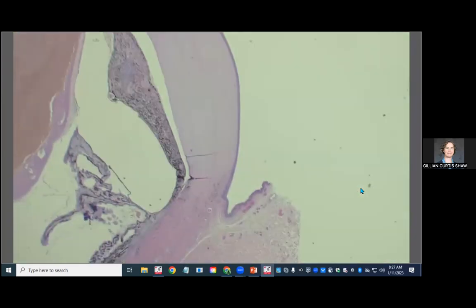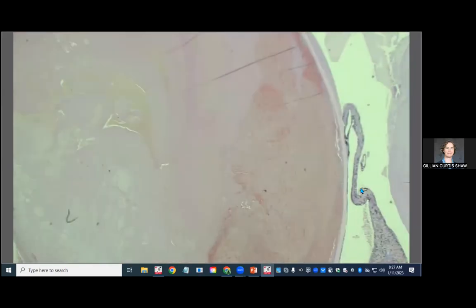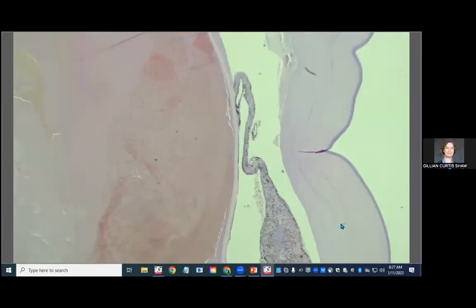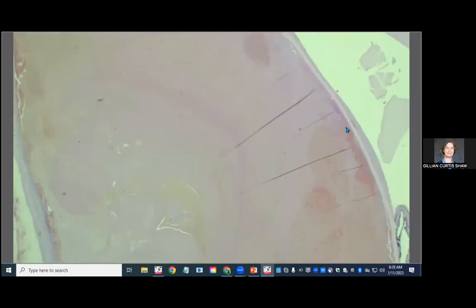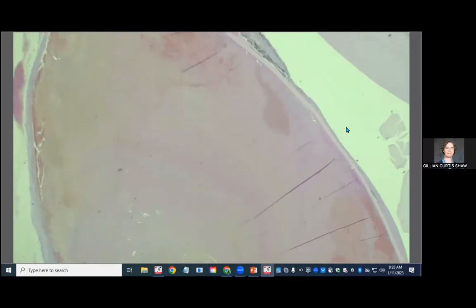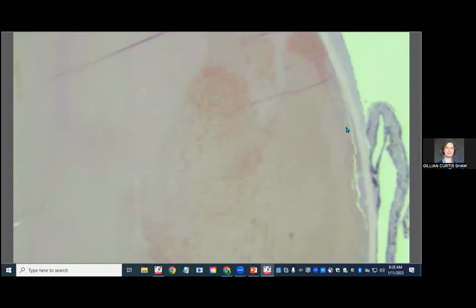So just to orient you, here's the cornea up here, and we're going to start on the lens before we do anything else. There is posterior synechia and iris bombé. You do see that this iris is fused to the anterior lens and thin and anteriorly bowed, but I'm going to skip straight to the lens because I think it's the most interesting. This lens has a pretty significant cataract going on. We would call it hypermature. There's barely any recognizable lens fibers here. It's basically just a capsular bag full of liquefied lens protein. And that lens protein is admixed with abundant blood and blood products.